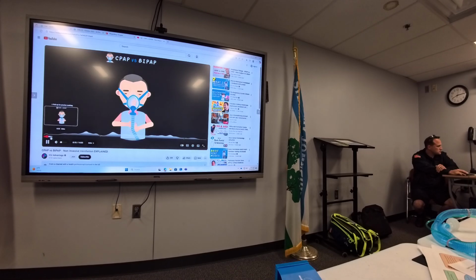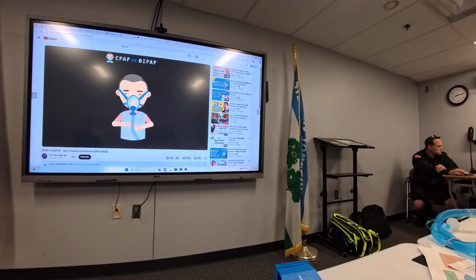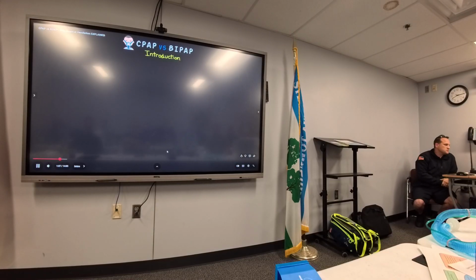Alright guys, welcome back to another lesson. In today's lesson, we're going to be taking a look at the differences between CPAP and BiPAP, topics related to respiratory therapy. I really encourage you guys to head on over there and check out his channel. Alright, let's get into our lesson and start off with an introduction. Essentially CPAP and BiPAP are two different versions of something we call non-invasive ventilation.